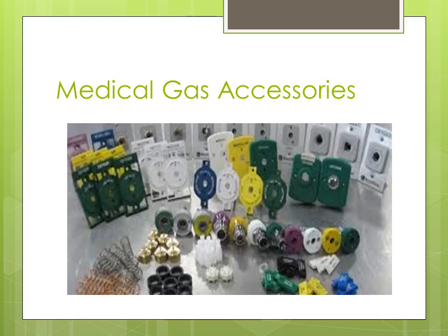Just another picture of different accessories as it relates to medical gas. I just saw this image, and you see all kinds of different things here. One of the things you see down here is some springs and some O-rings and some other pieces and parts. These are just different things, rebuild kits that you might have to rebuild an outlet. Just thought this image would be something that would be interesting for you to see.